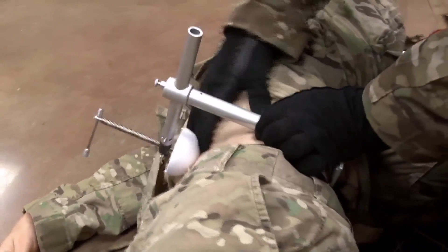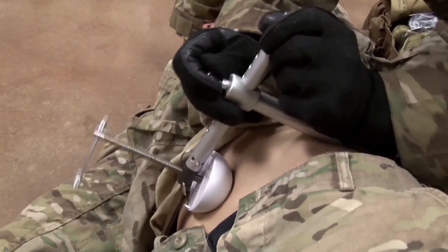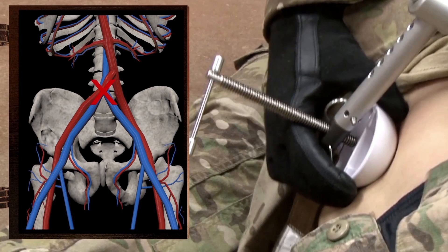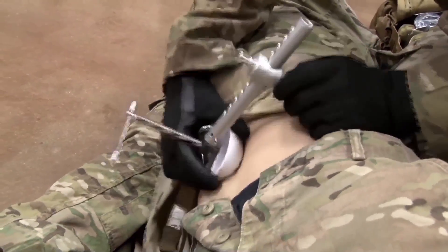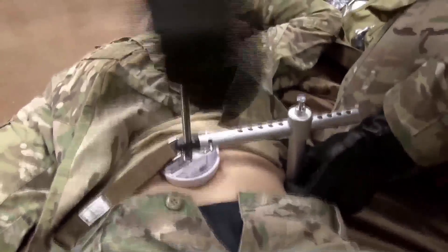For bilateral inguinal hemorrhage, or hemorrhage not controlled by distal pressure, as a last resort, pressure may be placed at the bifurcation of the abdominal aorta. Adjust the horizontal arm to position the pressure disc over the pressure point. Apply pressure by turning the T-handle clockwise.